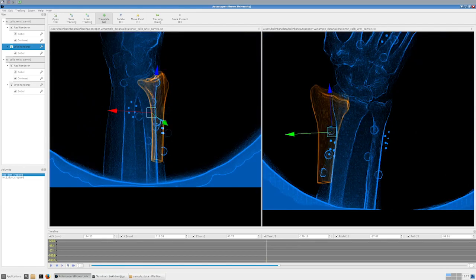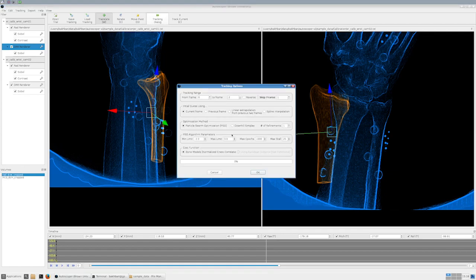Moving to the next frame — the sample data shows larger jumps to demonstrate a range of motion, but in normal acquisition frames are close to each other. In the Tracking Dialog you can use the previous frame as an initial guess for the next frame. You can also choose to use the previous two frames for temporal interpolation, change your optimization method, and adjust optimization parameters.